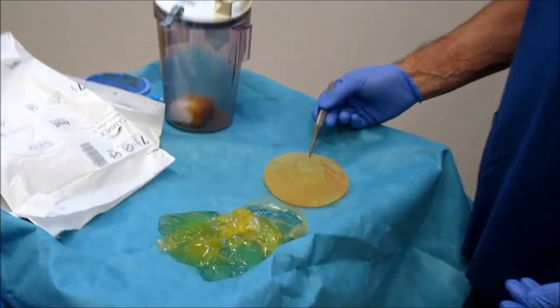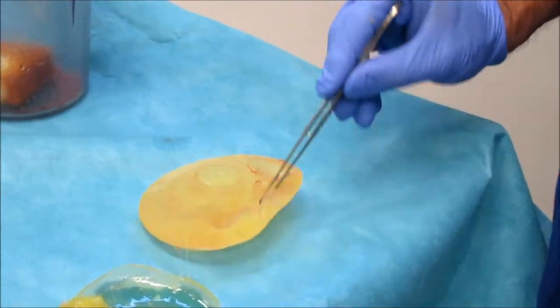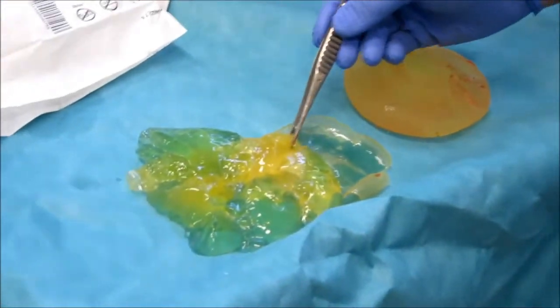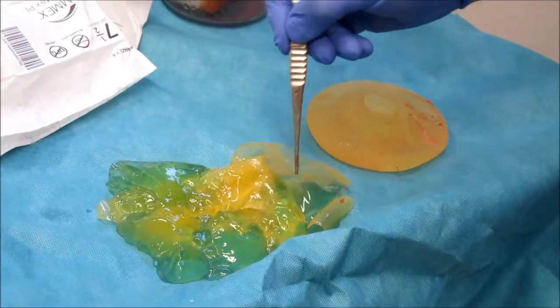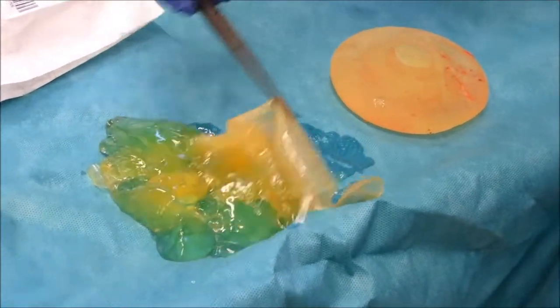So we'll just zoom in here. This is the implant that was intact — you can see it's a textured silicone implant with a textured surface. And this is the implant that had ruptured. There's still part of the membrane, the capsule or the wall of the implant, remaining.